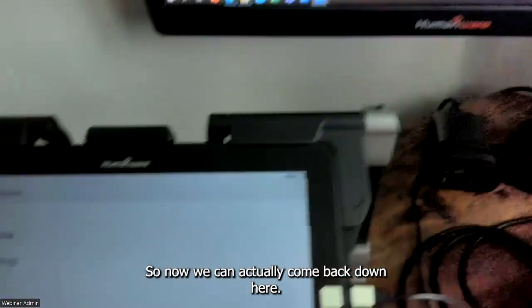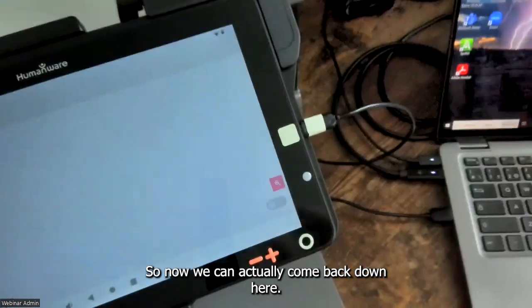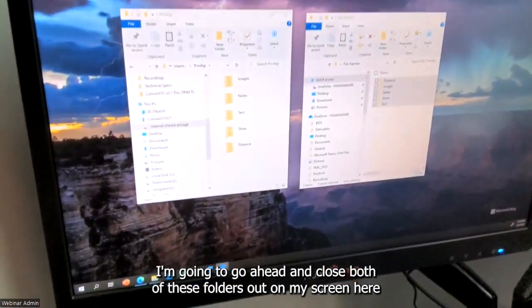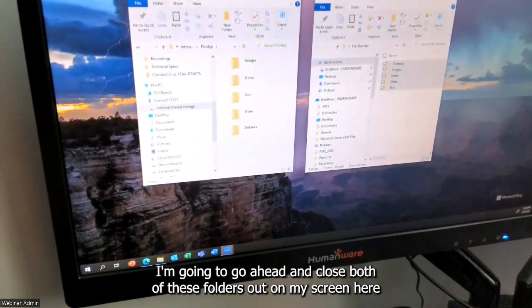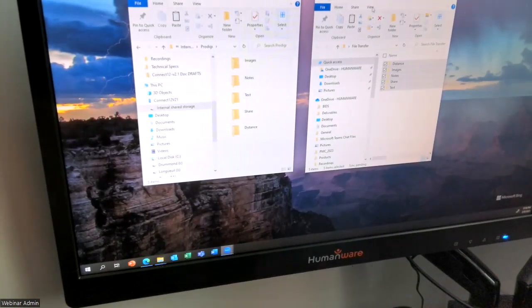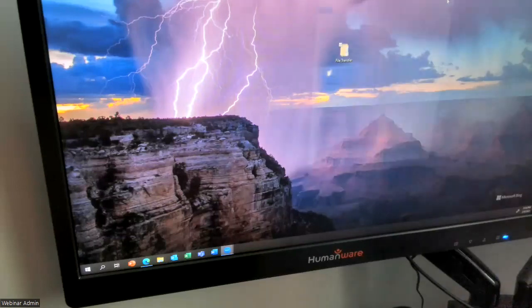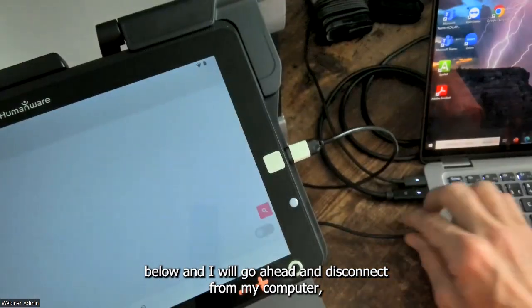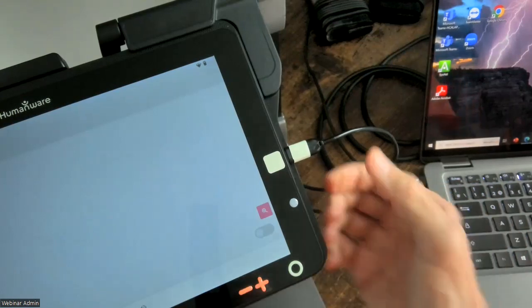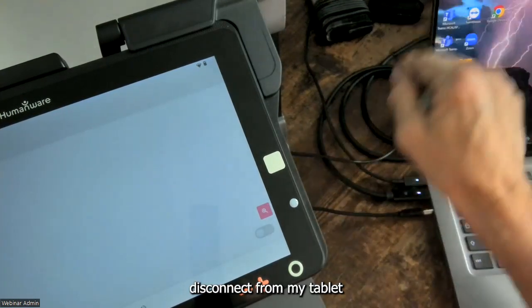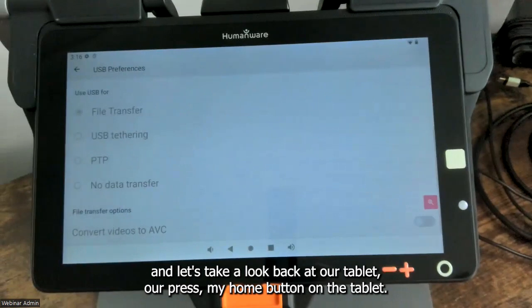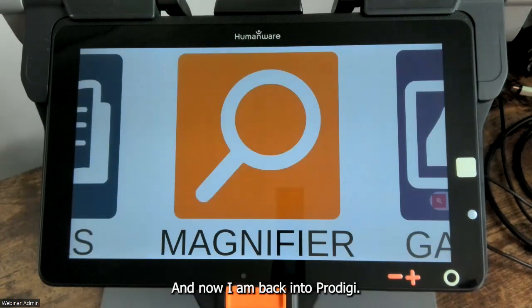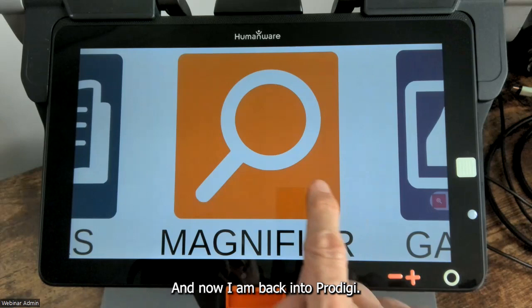Now I'm going to close both of these folders out on my screen, then disconnect from my computer and disconnect from my tablet. Let's take a look back at our tablet — I'll press the home button on the tablet, and now I am back into Prodigy.